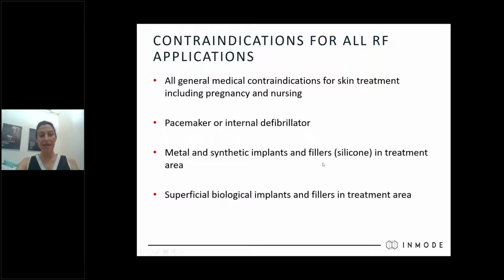I do take a minute again, as I did with the Morpheus, to talk about implants, silicone implants, and fillers, because of what we do here, okay? We work on the facial areas and stuff like that. So over silicone, we're not treating at all, ever. Over fillers, I recommend not treating over fillers because we do penetrate relatively not too deep into the tissue, just the right amount of depth in order to work on the dermal layer.